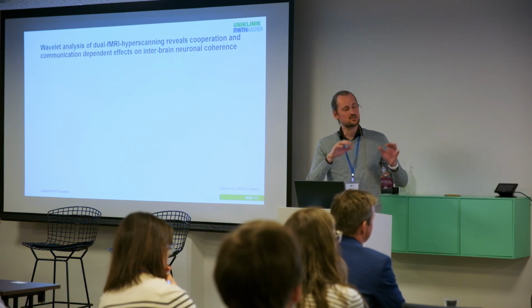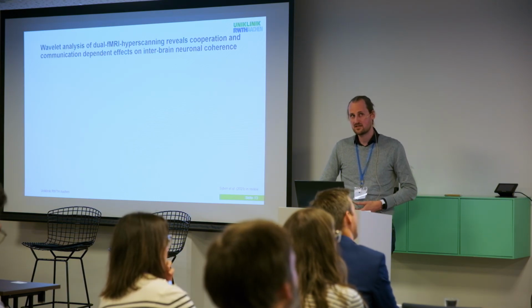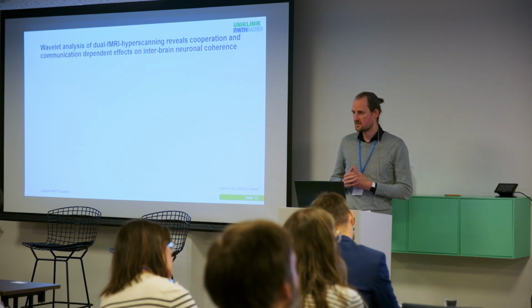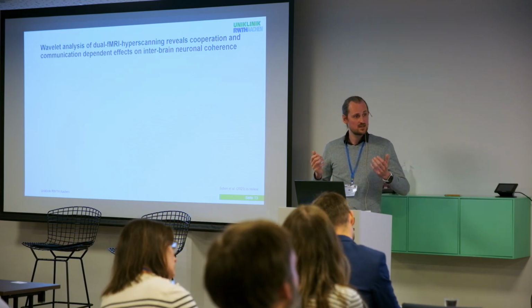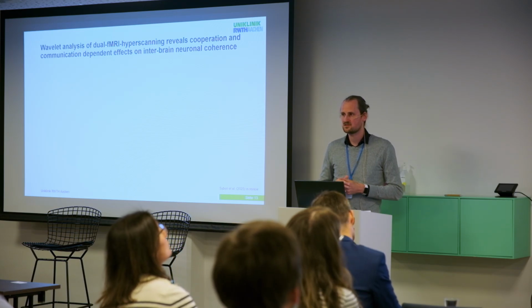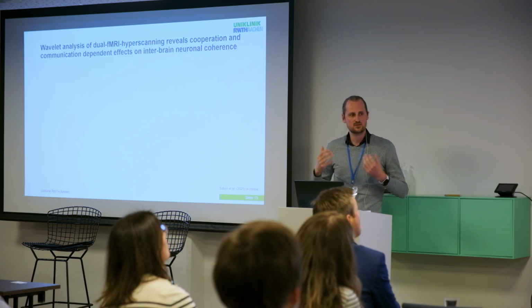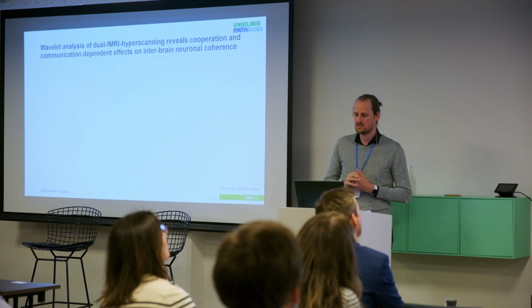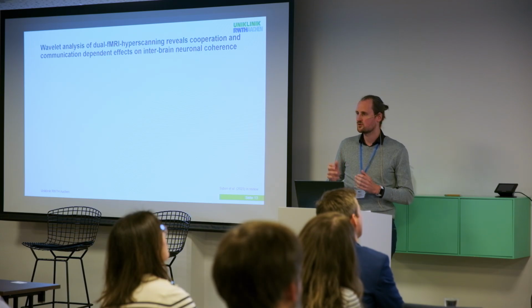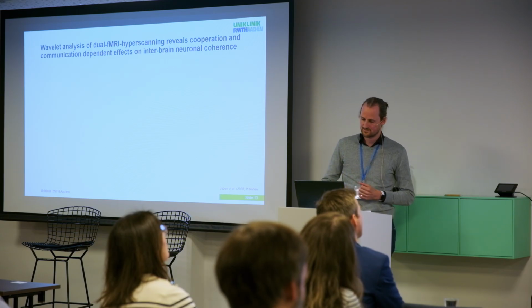So the study itself was a bit larger. Specifically, it was a study where we used wavelet analysis of MRI hyperscanning. So it's a hyperscanning study. We have the luxury of having access to 2 dedicated research MRIs, so we can perform hyperscanning studies where we measure 2 participants simultaneously, and then use different analyses to measure not just neural activation, but interbrain neuronal coherence.